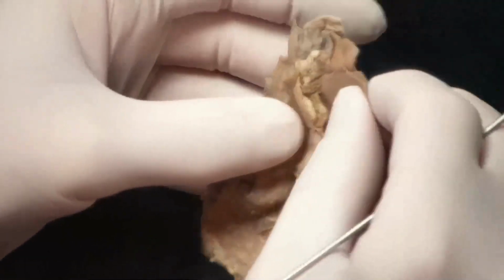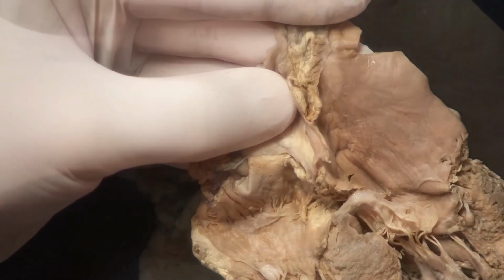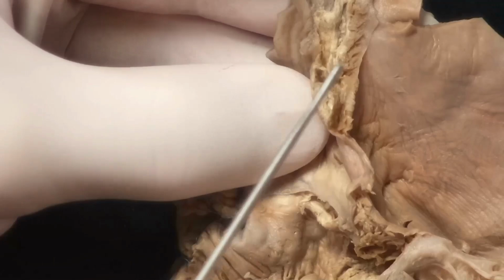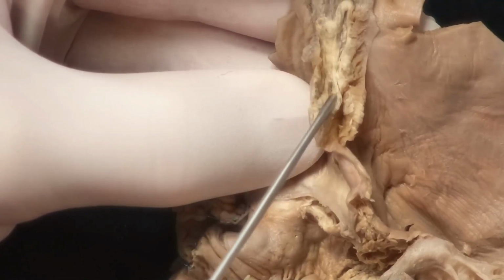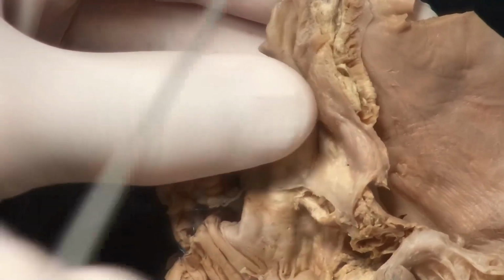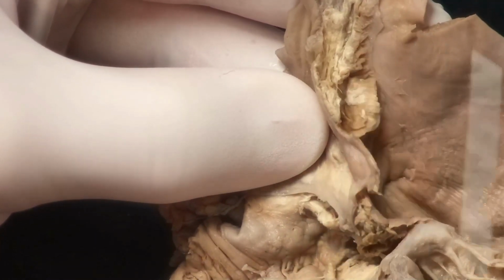If we go too posteriorly, looking here at the posterior aspect, you can see there that there's an infolding of the atrial walls. This is what's sometimes called the secondary septum, and you can see that actually it's an infolding of the atrial walls with fatty tissue, extracardiac fatty tissue in between. So if we perforate this, if we go too posterior, then of course we risk going outside the heart and creating tamponade or a pericardial effusion.